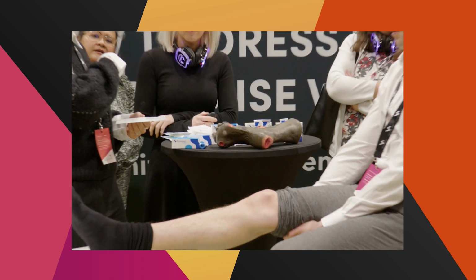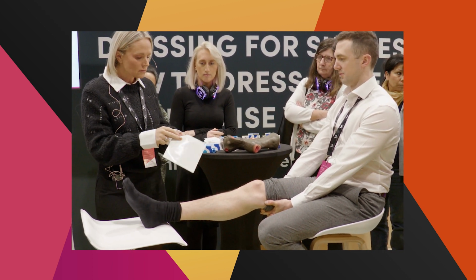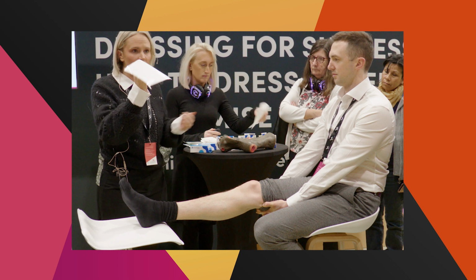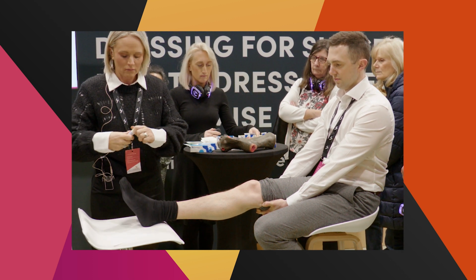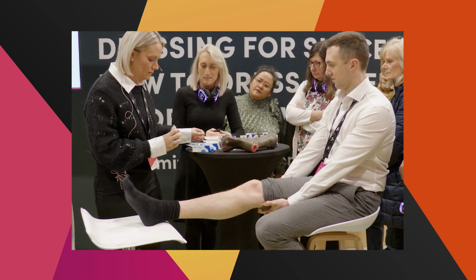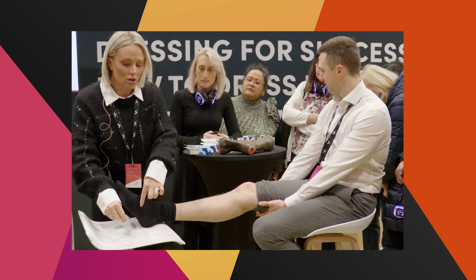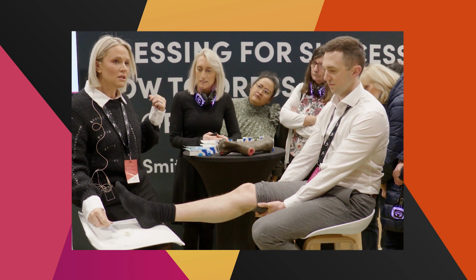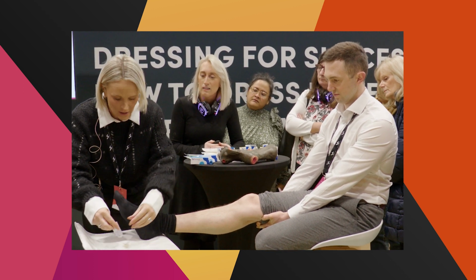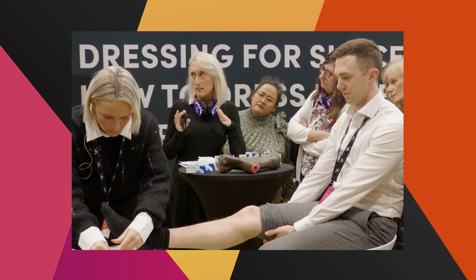Flaminol Forte, and Louise in a moment will go through the mode of action and why we choose which one. Just take the one backing off it, and don't take the other bit off. So while I put this on Adam's leg, Lou's just going to run through the mode of action and the reason why I would choose Flaminol. So Sam's chosen to use Flaminol Forte here, but we have the Hydro as well. So we have the two variants of Flaminol.